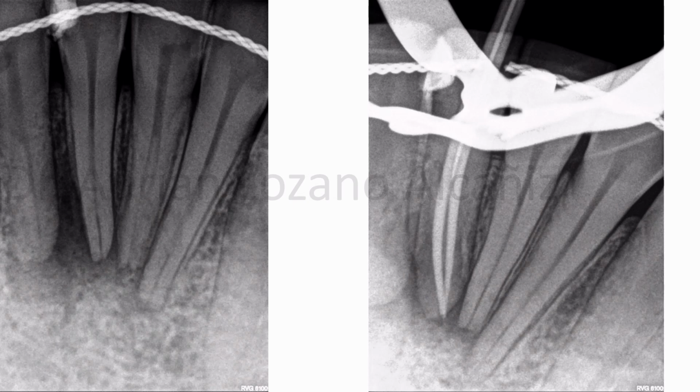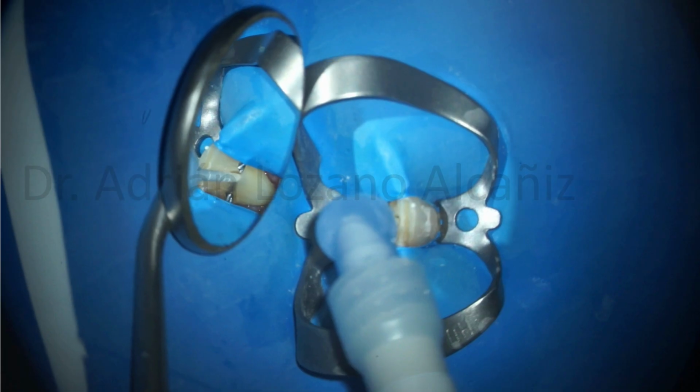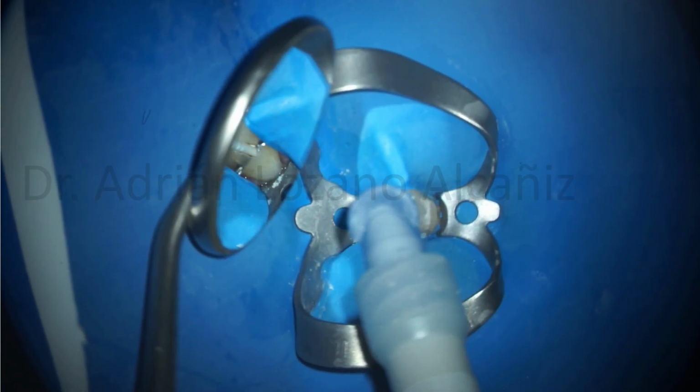Now I'm going to show you some cases of this new material. I only have a 3 months recall because it's very new. This is a 41 with symptomatic periodontitis. We clean and shape. Here is the cone fit. We have 2 canals. We put the sealer with a tip.